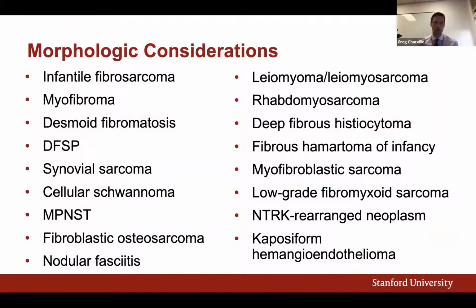At this point, I'll leave this more for the discussion with the group, but I'll offer, admittedly, quite a broad, almost silly, morphologic differential that includes a vast array of things. I'll highlight some components. I think certainly a nerve sheath tumor is on the differential diagnosis. Typically it's quite unusual, even in the context of neurofibromatosis. Again, this is a newborn patient, so the patient certainly may have a germline genetic predisposition. Even in neurofibromatosis, it's quite unusual to have congenital MPNSTs.